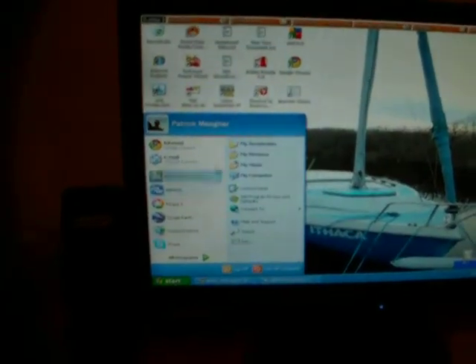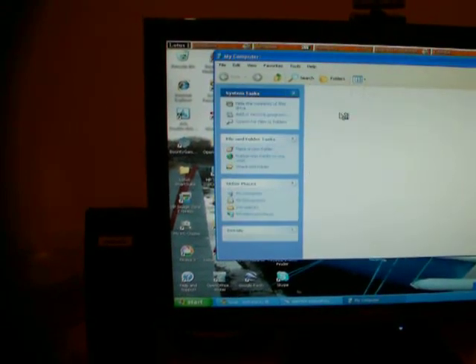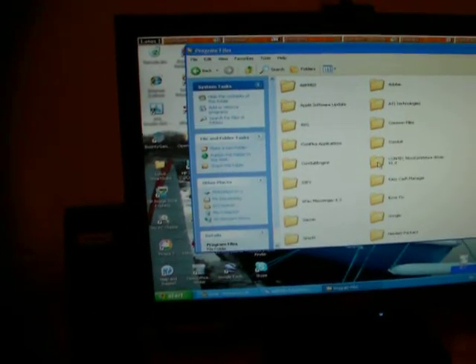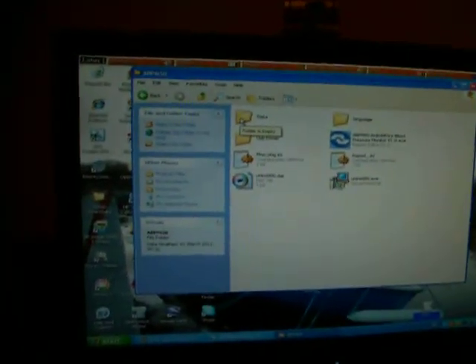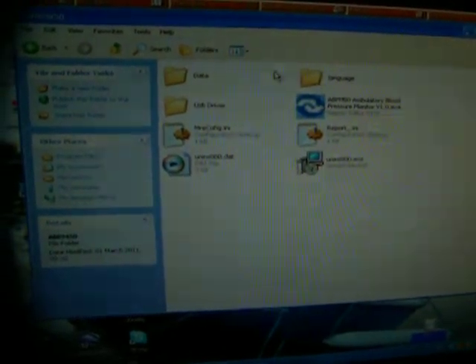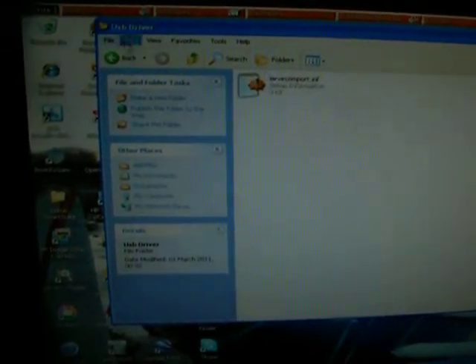I will open up the file so that you can see the file. There you can see all the different pieces. The execute file, language data, and the USB driver file. And that is the program — you can see it is 3 kilobytes on the side.